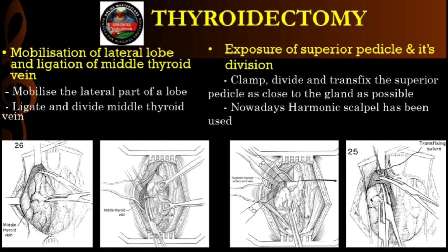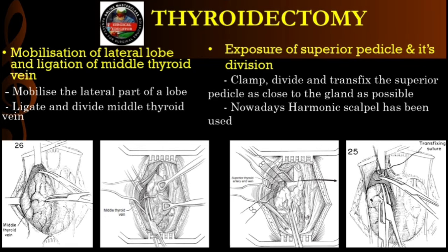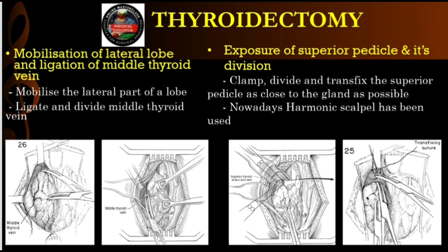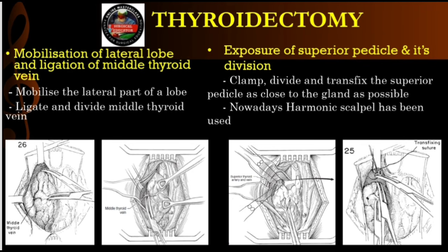It is. When you grab the vessels with the jaws and activate it, that intense microscopic friction denatures the tissue proteins. They melt into a highly secure, sticky coagulum that seals the vessel permanently. And it cuts it at the same time. In one fluid motion. 3 seconds, and the pedicle is divided. And because it's friction, not electrical heat, the thermal spread is minimal, right? Less than 2 millimeters of heat radiating outward, so you don't accidentally cook the nerve sitting right next door. Technology perfectly augmenting anatomy. Incredible.